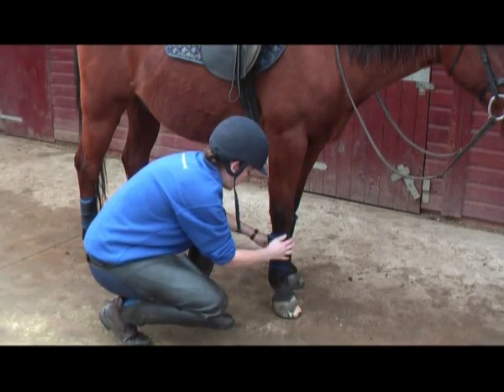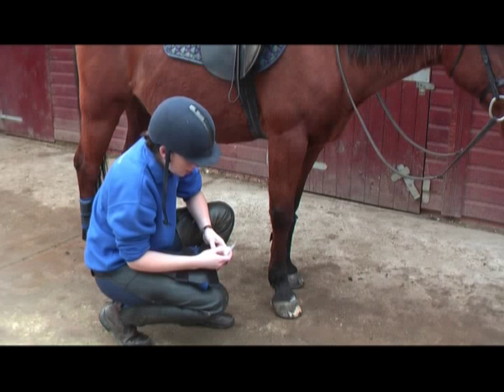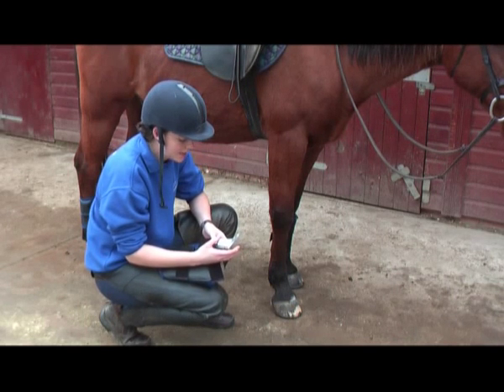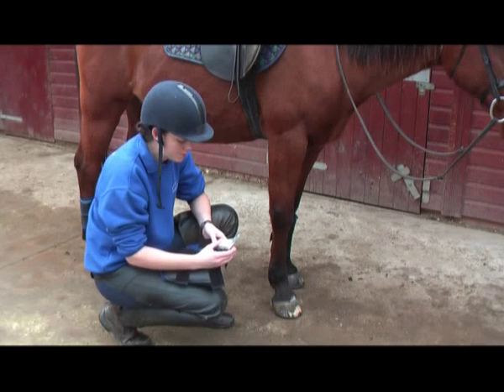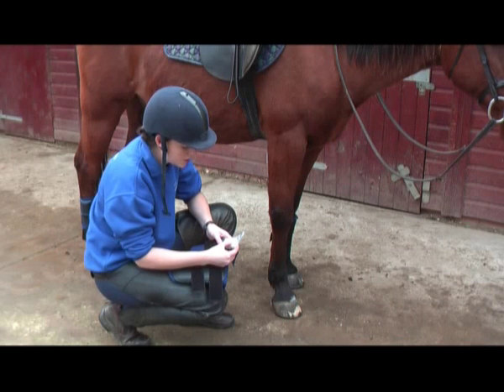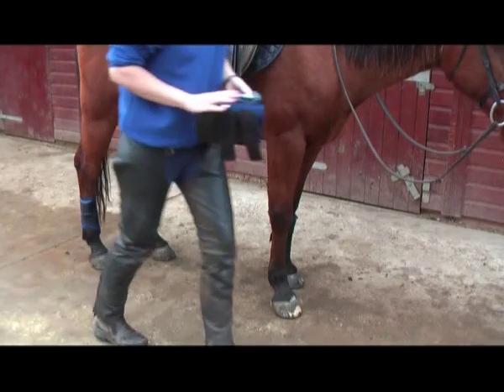As I'm taking off my boots, I want to switch off my sensor. I open my pouch and look at the sensor — ideally I want to see only a green flashing light, because this means up to this point we're still collecting data. If any other lights are apparent on the sensor, please confer with your manual. With this sensor there is only a green flashing light, which is perfect. I switch my sensor off by pressing the small black button. And that's my sensor off. I do this with all three other legs now.